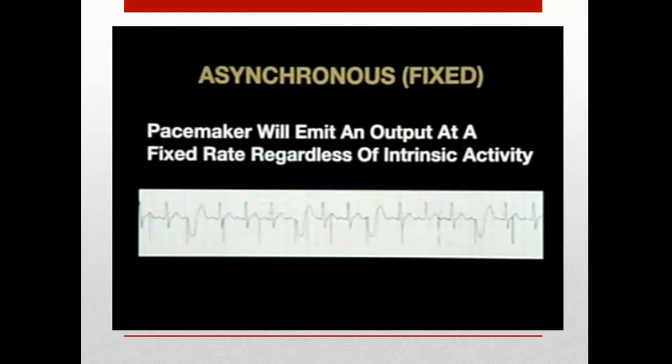All right, so an asynchronous pacemaker will deliver a stimulus regardless of any intrinsic activity at whatever rate the pacemaker is set. So it is fixed, it is set, it's going to give it no matter what's going on.